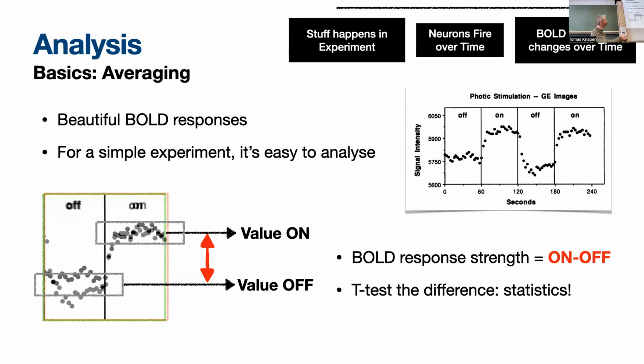Oh yeah, so this is averaged across voxels, which is why it looks so nice. That's a problem. This is a specific type of analysis that we call a region of interest analysis, and we'll go into that in the practicals also, why that would be different from just doing analysis on every voxel. So good point. I'm talking about, though, I was targeting another one that you can see from the time scale here.